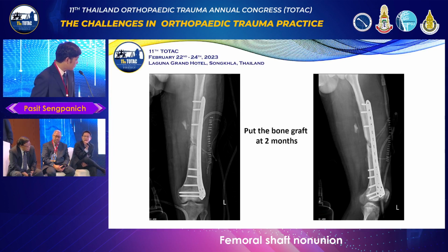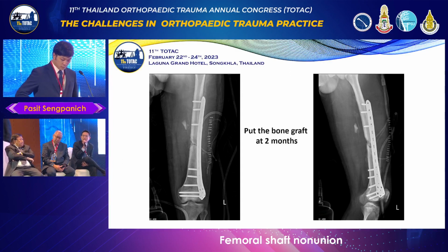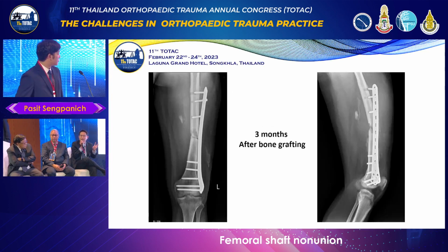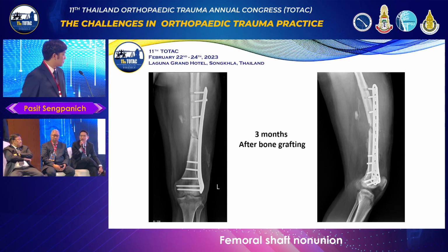So, for me, the clue is if the metal comes out of the bone, I usually think first of poor quality of the bone, and the other thing is whether there is any bone pathology from infection that cannot hold the screw. And if you see a broken implant, I usually think it's because it's unstable, it moves a lot, but it's aseptic. But in this case, the screw just came out, and I'm not sure about either the second proximal one. It is a locking screw, but it's not locked when it comes out of the bone.